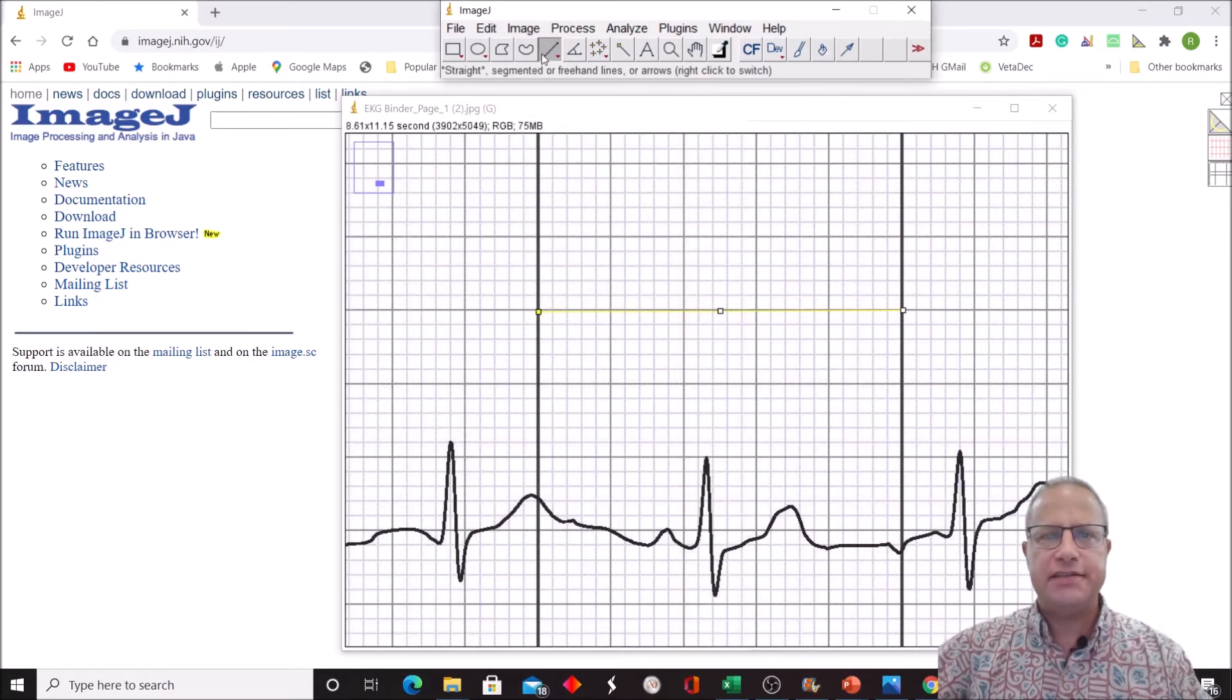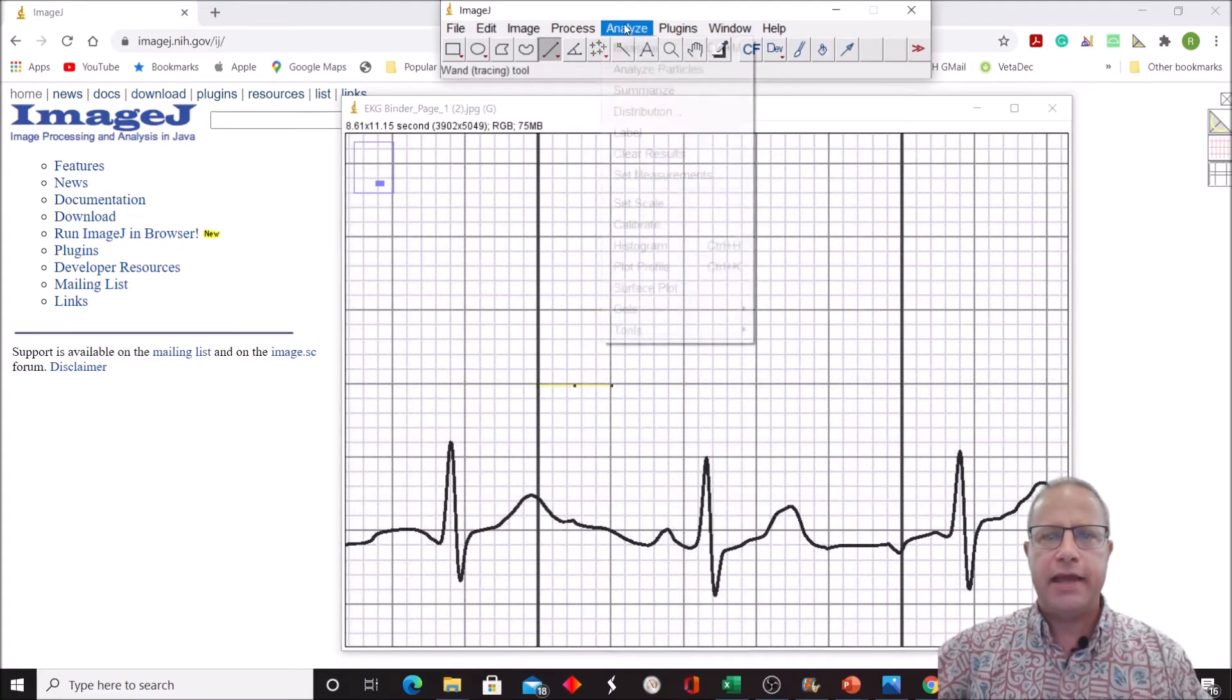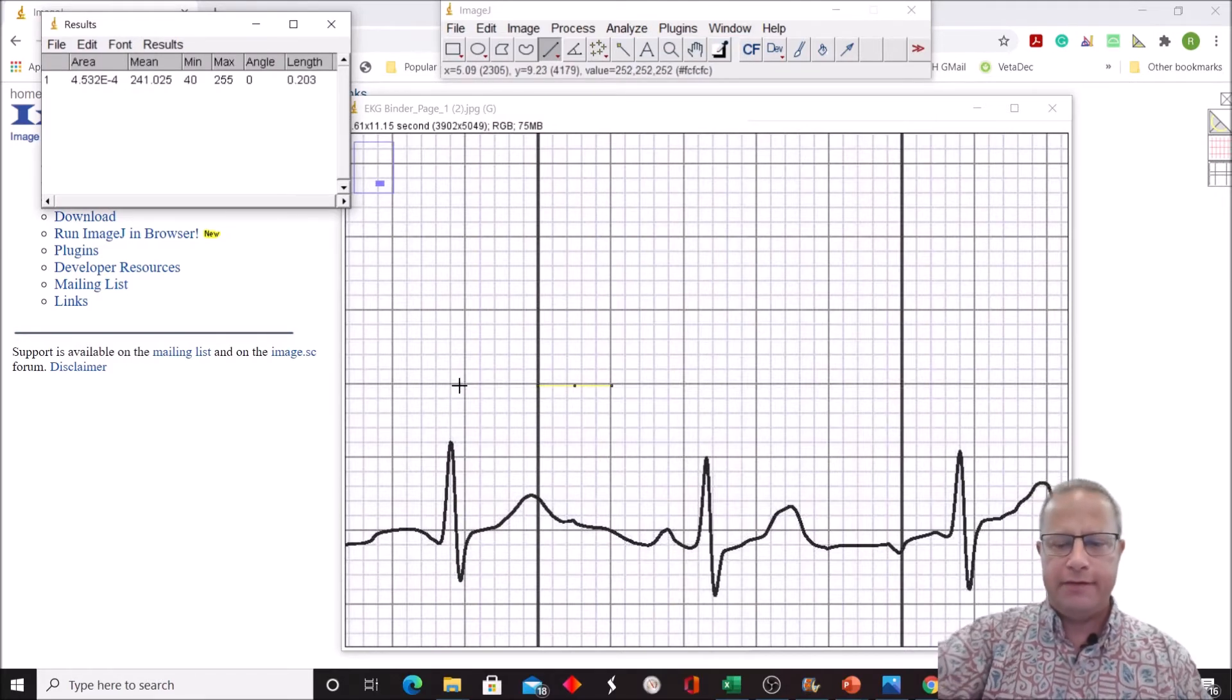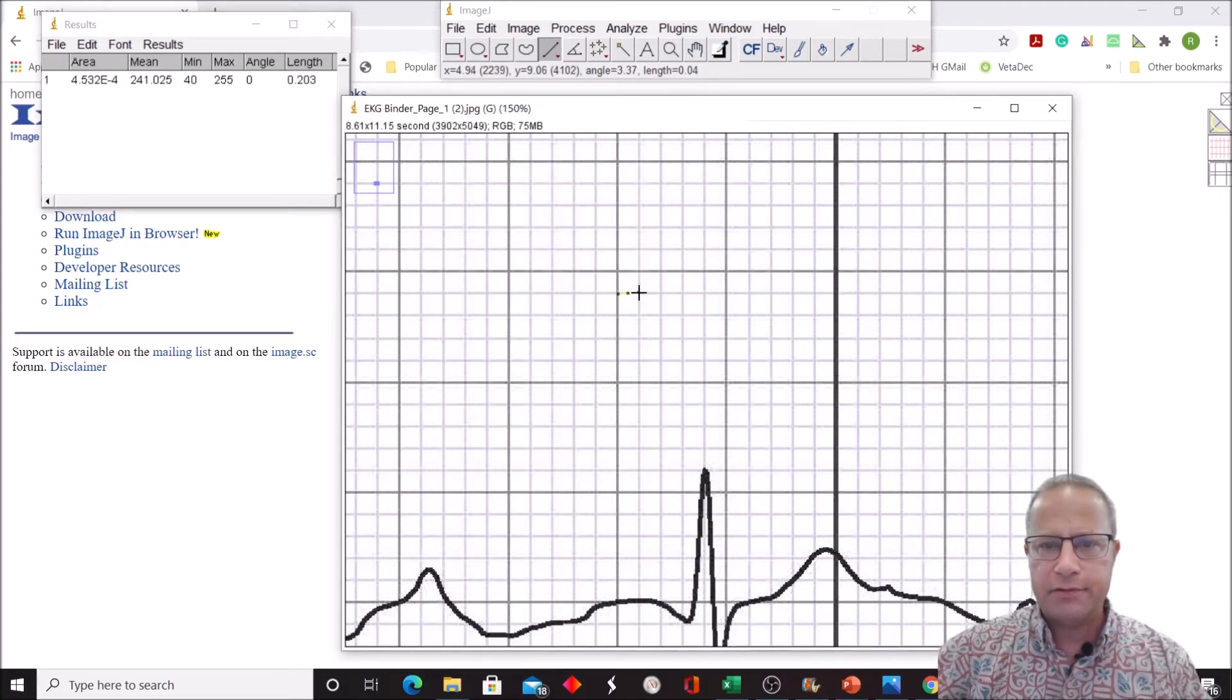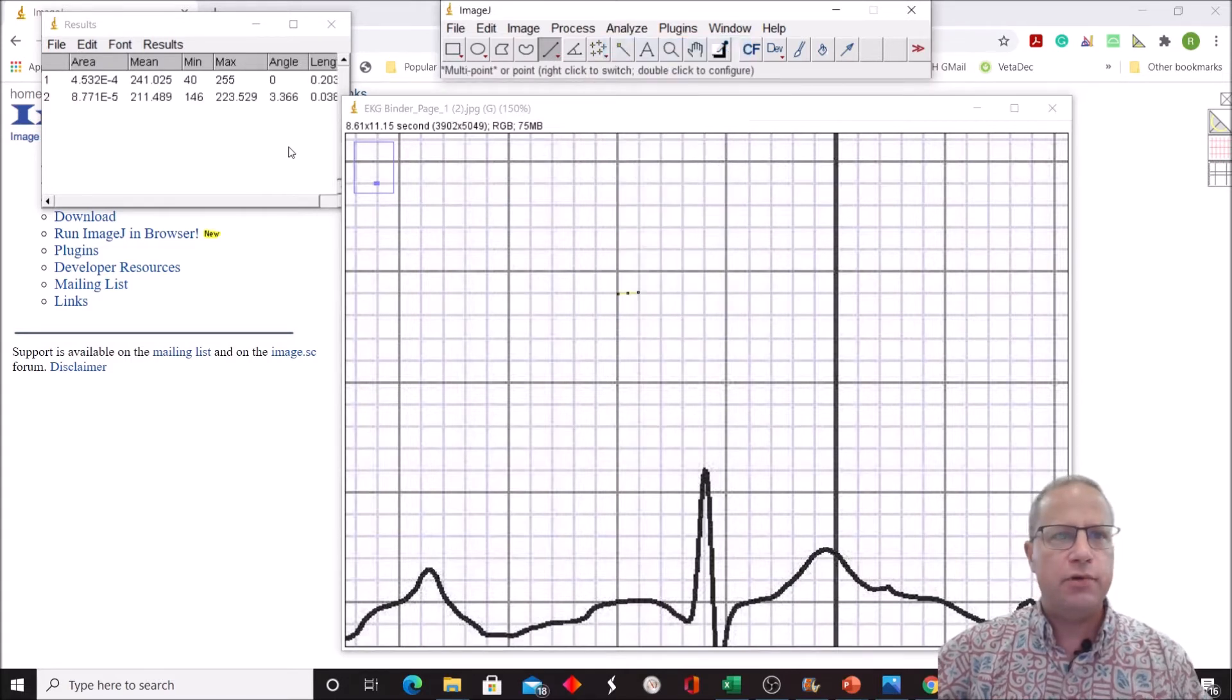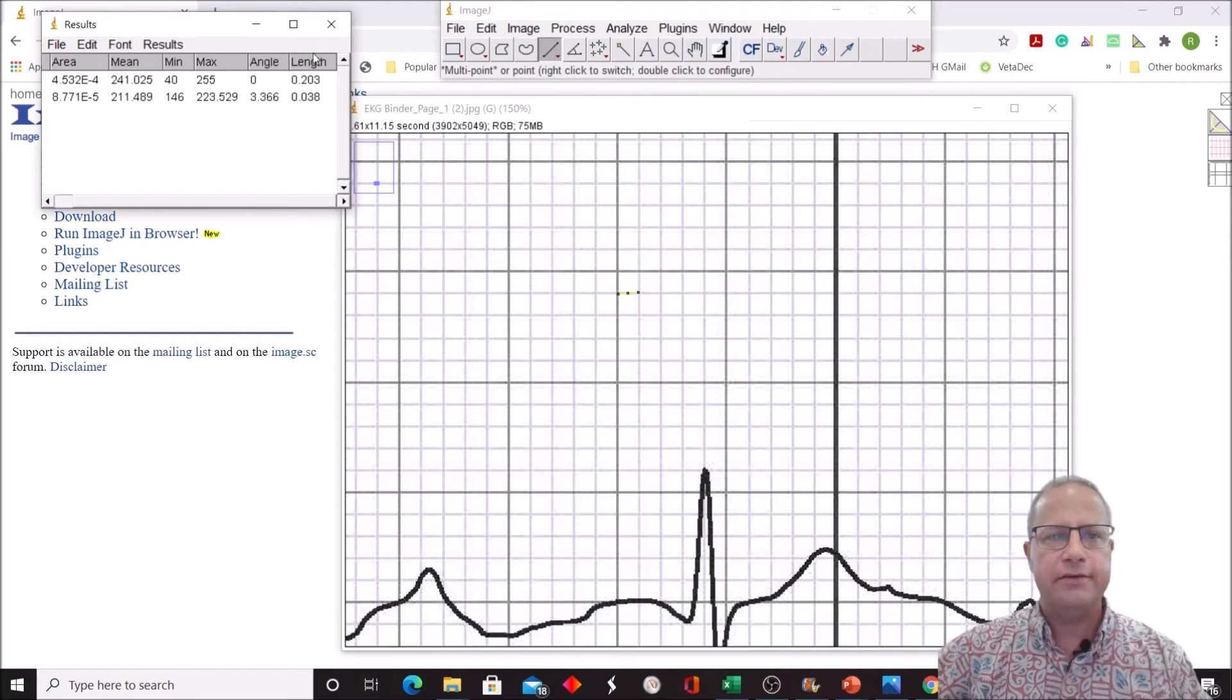Now if that's all set and I measure one big box, it should come out to be around 0.2. Let's do that. Analyze, measure. 0.203, close enough, good enough for government work. If you want to zoom in to a small box, remember they're supposed to be 0.04 seconds apart. Analyze and measure. 0.038 something, that's fine, close enough.